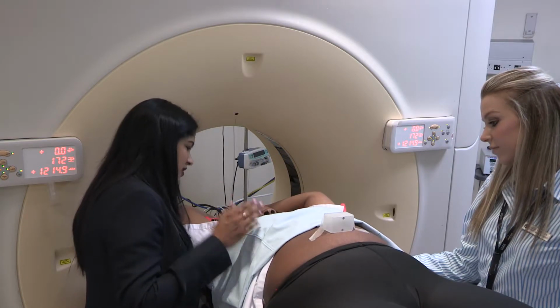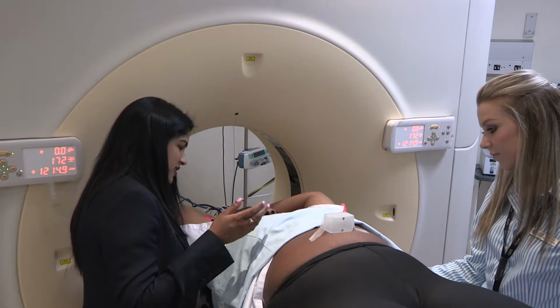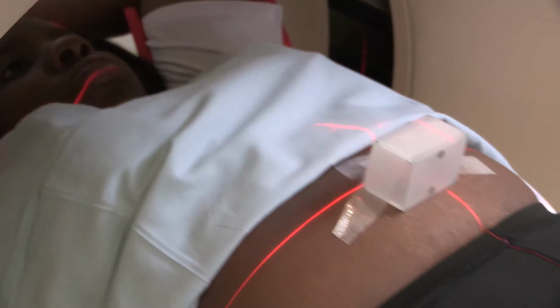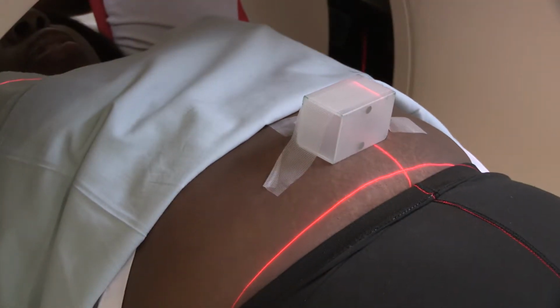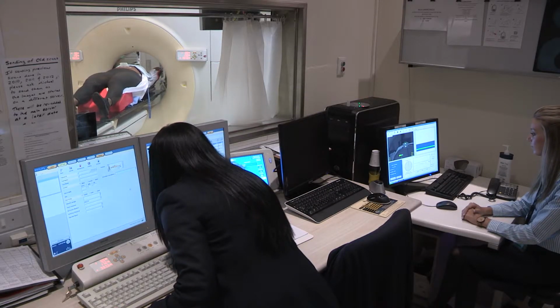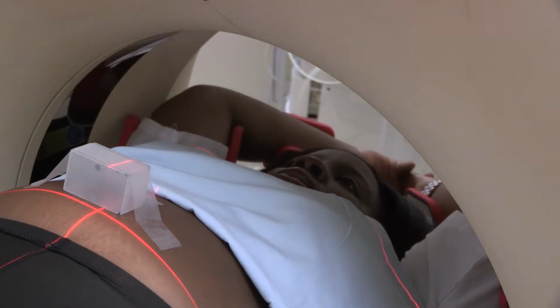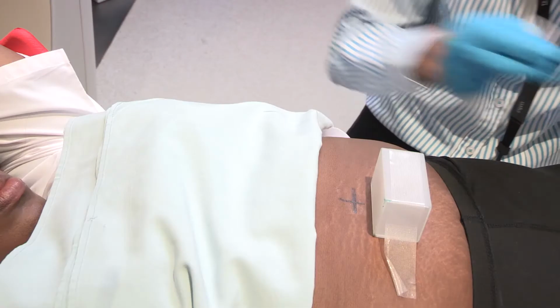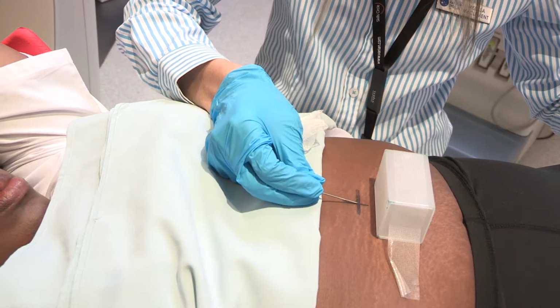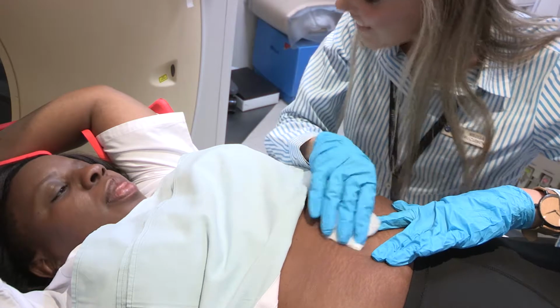Prior to performing the actual CT scan, you will be asked to practice the breathing technique. When the correct rhythm is found, the planning CT is made. Throughout this procedure, you will receive voice instructions via an intercom. The scan procedure takes approximately 30 minutes, and at the end of the procedure, semi-permanent tattoos are made on your skin with a needle and ink as references for your daily treatment.